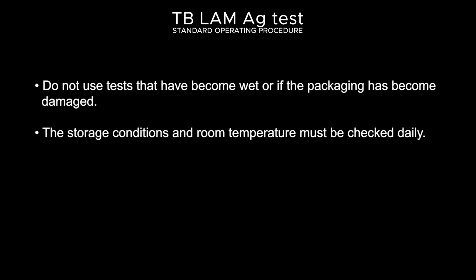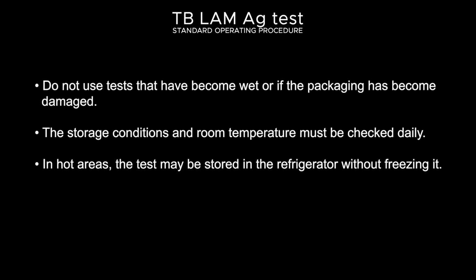The storage conditions and room temperature must be checked daily. In hot areas, the test may be stored in a refrigerator without freezing it. Immediately reseal all untested tests in the foil pouch containing the desiccant by pressing the seal from the end to close.